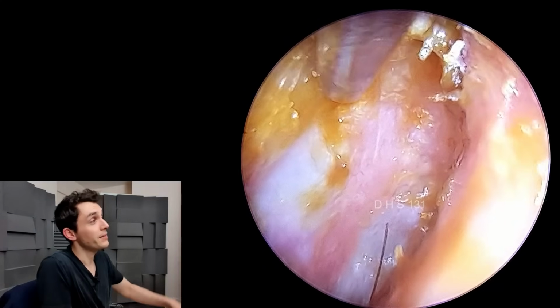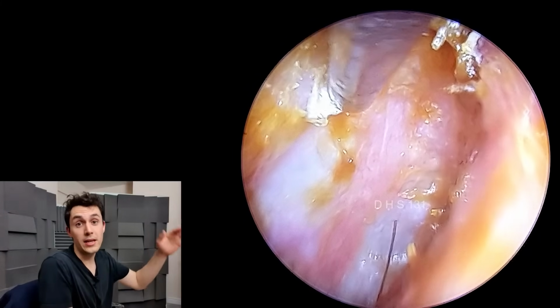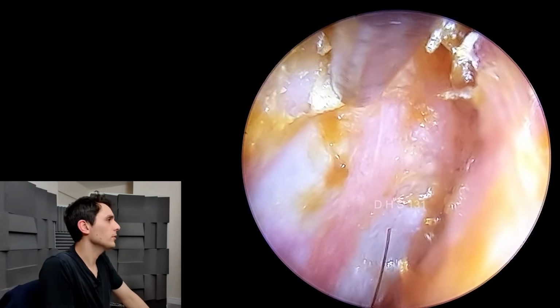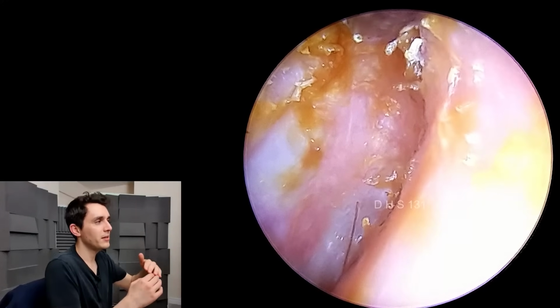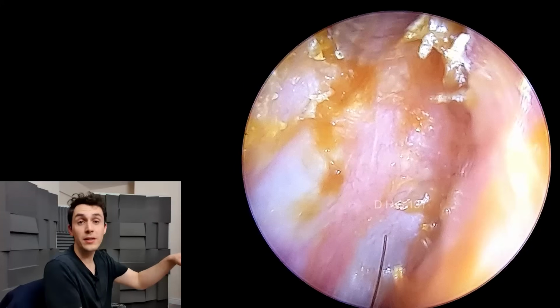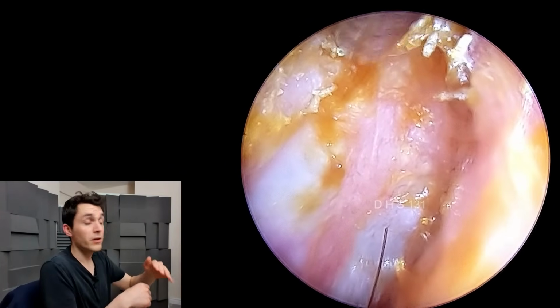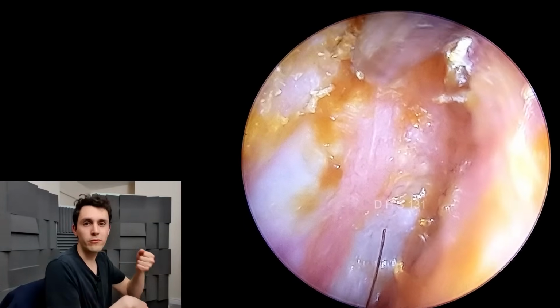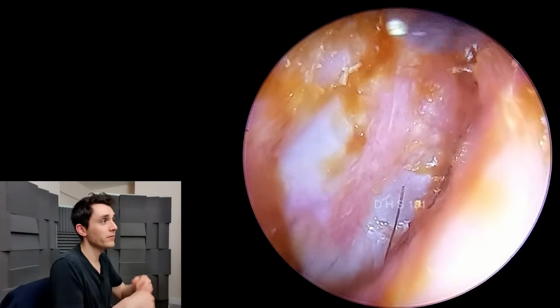Just peeling this last little bit around the attic. By attic I mean the term used to describe the area above the eardrum. Broadly speaking, we tend to think of that part of the anatomy in three sections. The main part of the eardrum, the lower two thirds, is the pars tensa because the eardrum's rigid and tense. Then the top little part of the eardrum is the pars flaccida because it's floppy, and then the top part where I was suctioning we tend to call the attic. So there we go, a fairly good outcome.